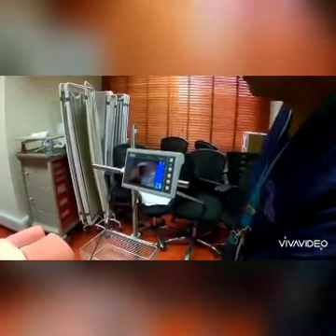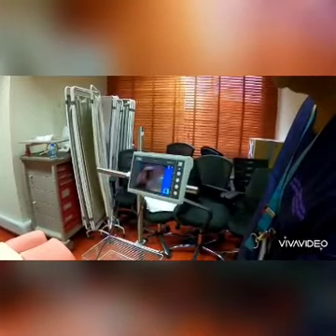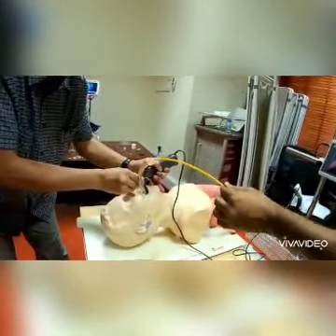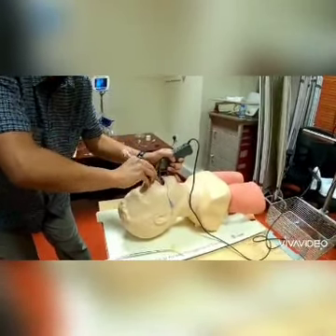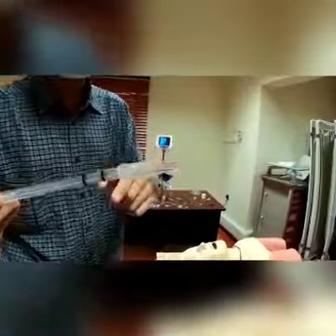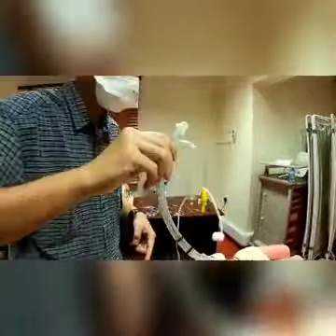Most of the time at this stage, your ET tube will be stuck there, just before you go through the vocal folds, at the arytenoid. A way to get around this is to turn it; don't force it. Turn your ET tube anti-clockwise 90 degrees. Once the ET tube bevel is upwards, now you can push and it will just go straight in, and you do the same technique, you stop between the two lines. Just to show you, this is the bevel, if you've not seen it before. If you want to get it through the vocal cord easily, you turn it anti-clockwise, and then hopefully it should just go in very easily.